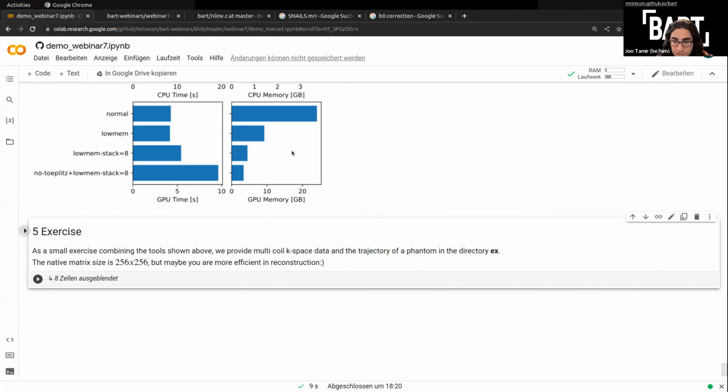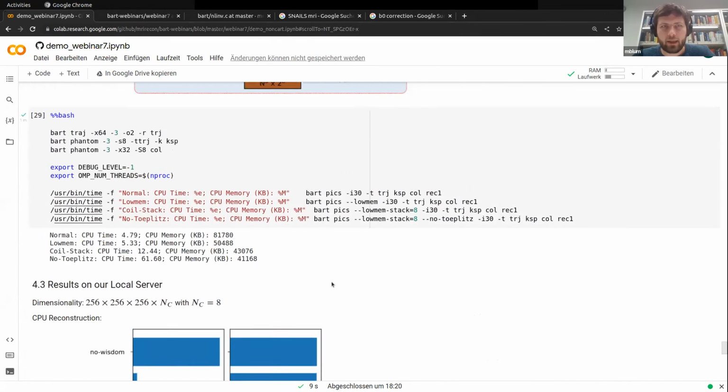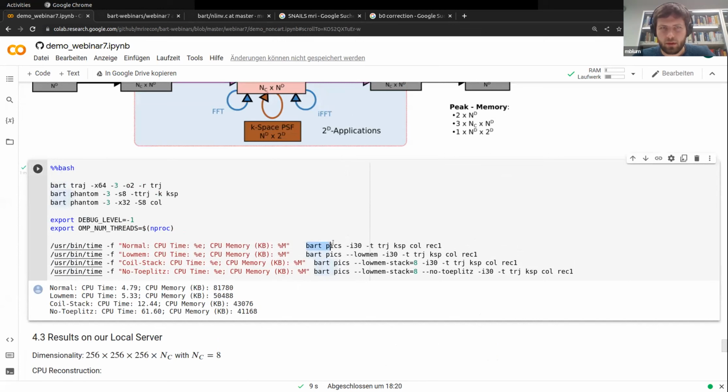So I unfortunately have to run. The question is, can the low memory option be used with eSPIRiT, and can it be used in the pics tool? Sorry, can you repeat the question? The question is if it can be used in the pics tool, and I think that's what you were showing, right? Yes, it is used in the pics tool. This is precisely to serialize the computation of the NUFFT as part of this iterative reconstruction. So that's why it's nice to be able to do that.